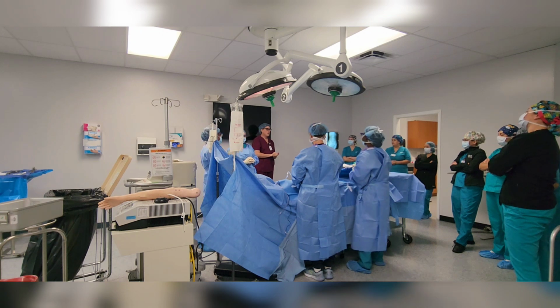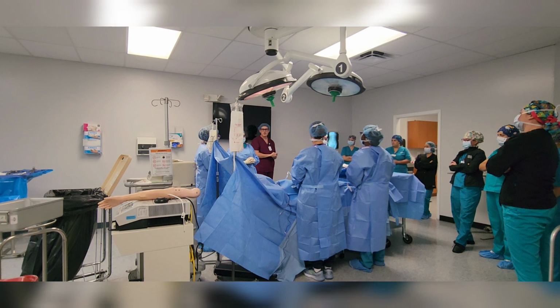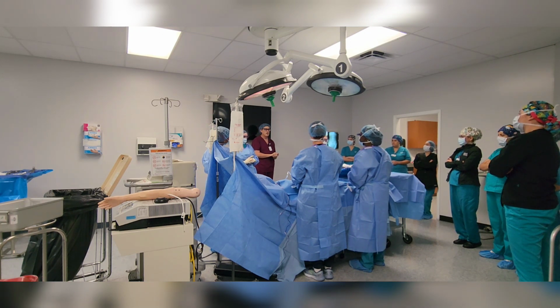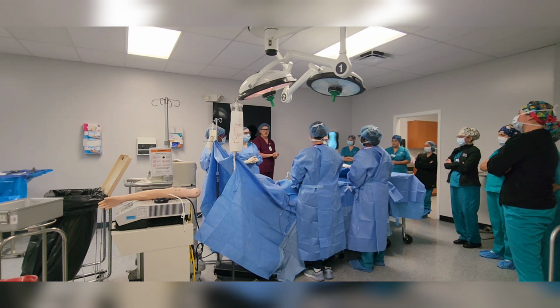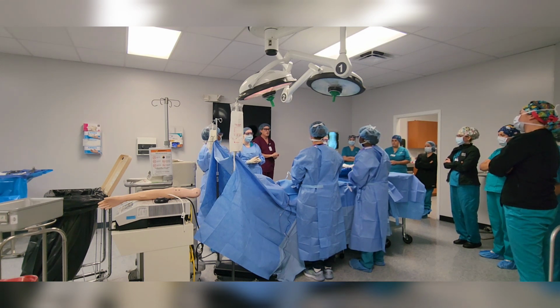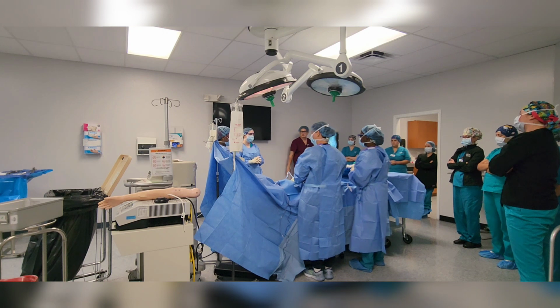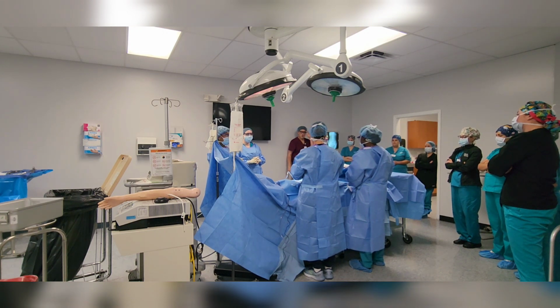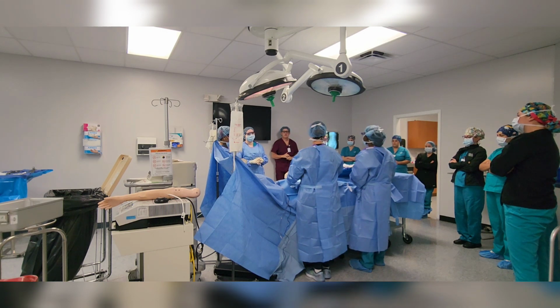This is John Smith. He's having an open appendix surgery, has no allergies, has 2 grams of Ancef. What kind of medication do we have, surgical tech, Brooke? 1% xylocaine with epi. Does everyone agree? I agree with that. Does everyone know each other? Hi, I'm Brooke, a student. Nice to meet you. Does everyone agree? Great. And then at that point, you'd say what you need to say, anesthesia, and then the surgeon would say what they need to say. Okay. Then what do they need next?